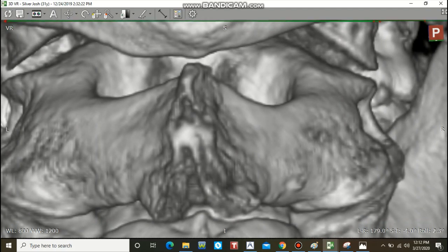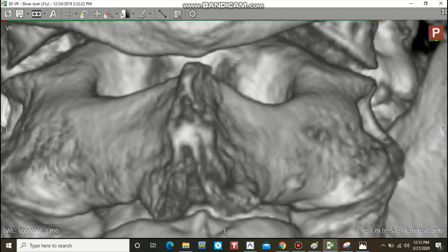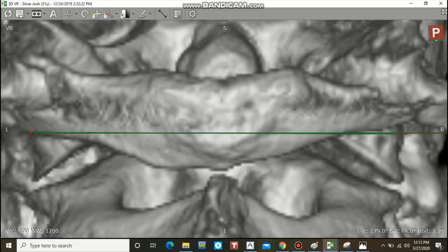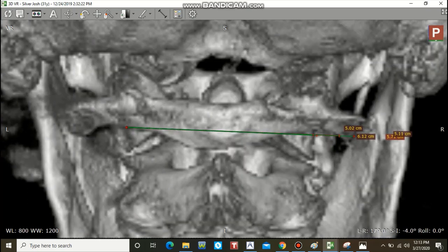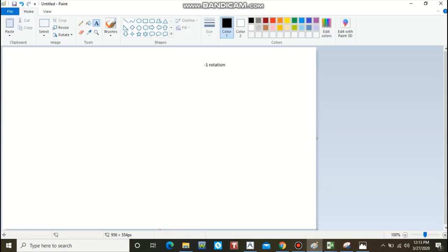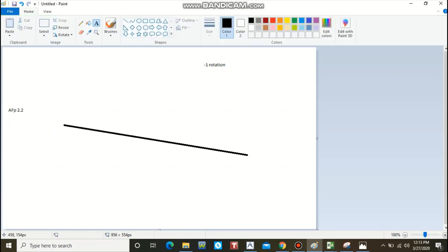So what we know now is that the AFP is high by 2.2 degrees — high on the left. I'm going to put on my sticky note: AFP 2.2. We don't know what side it's on yet because we don't know the laterality, so I'll do that next.